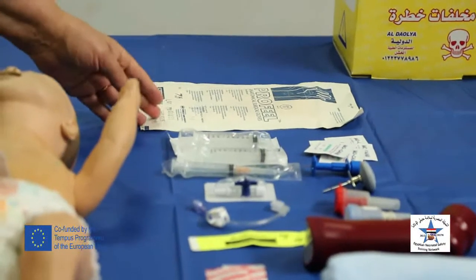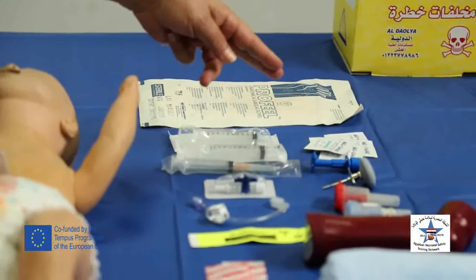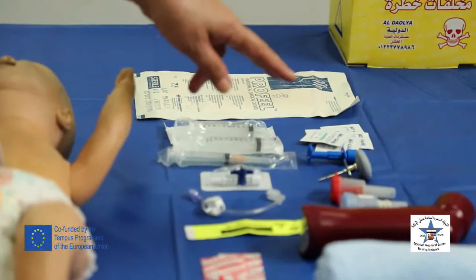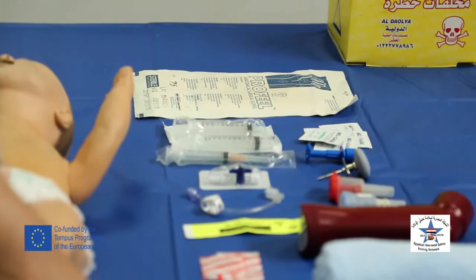The equipment needed for this procedure is a sterile glove. We need alcohol swabs or any antiseptic solution. We need the insertion needle of different sizes according to the weight of the baby.